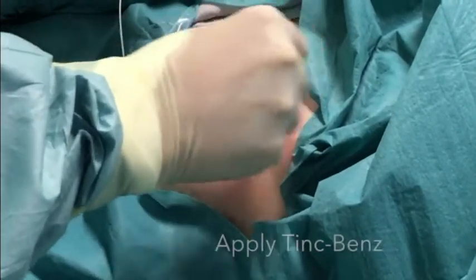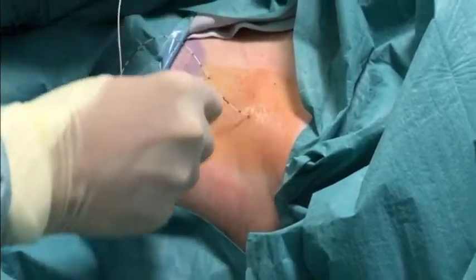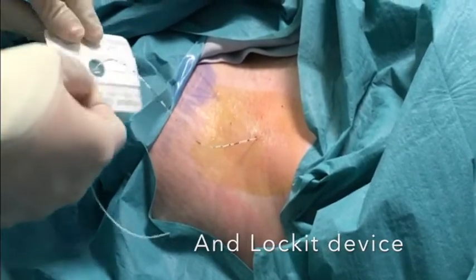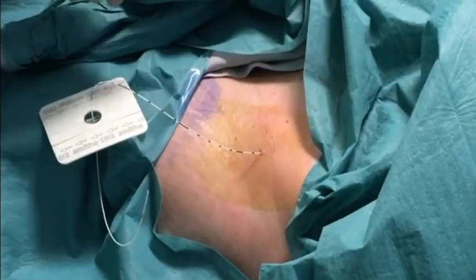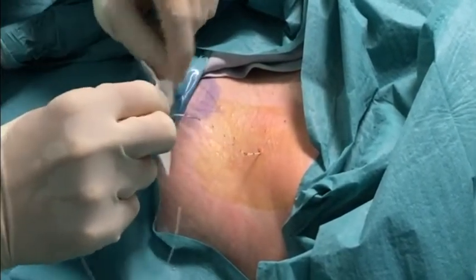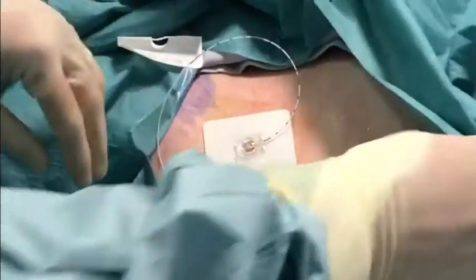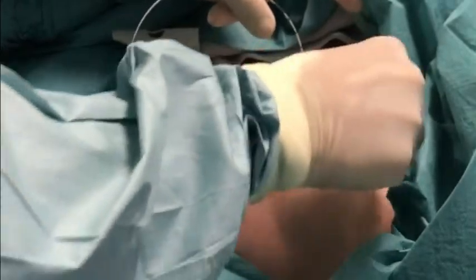Before securing the catheter, apply tincture of benzoin, which is an antiseptic, and dermabond glue around the catheter entry site. Take a 16 gauge Lockit device and thread this onto the catheter. Apply some more dermabond if necessary and then thread down the Lockit device. Peel away the foil backing and stick this down securely. Then fold back the catheter and firmly clip it into place. Apply some more dermabond glue to where you wish to fix the filter, bearing in mind the surgeon's access to the hip during surgery.